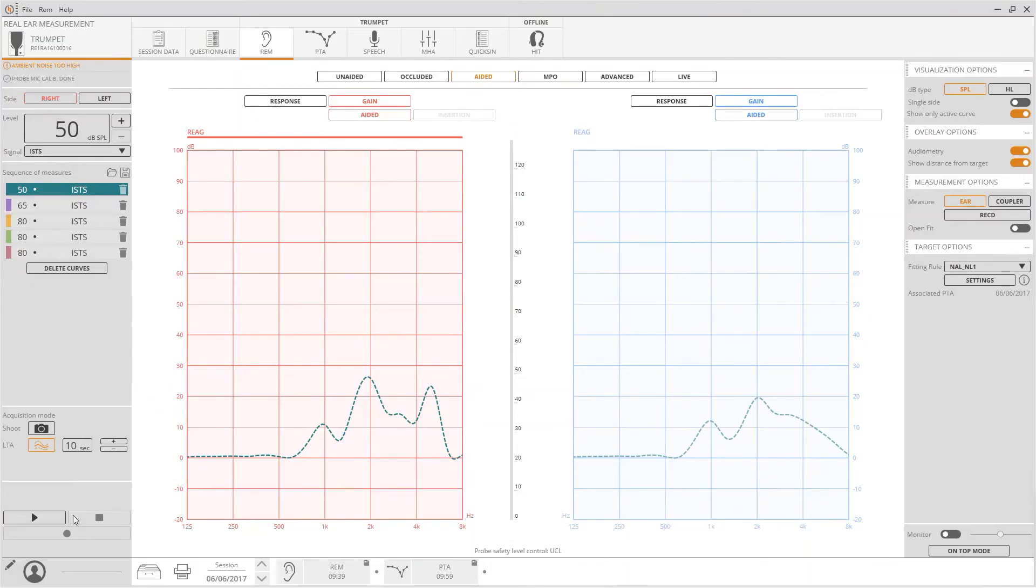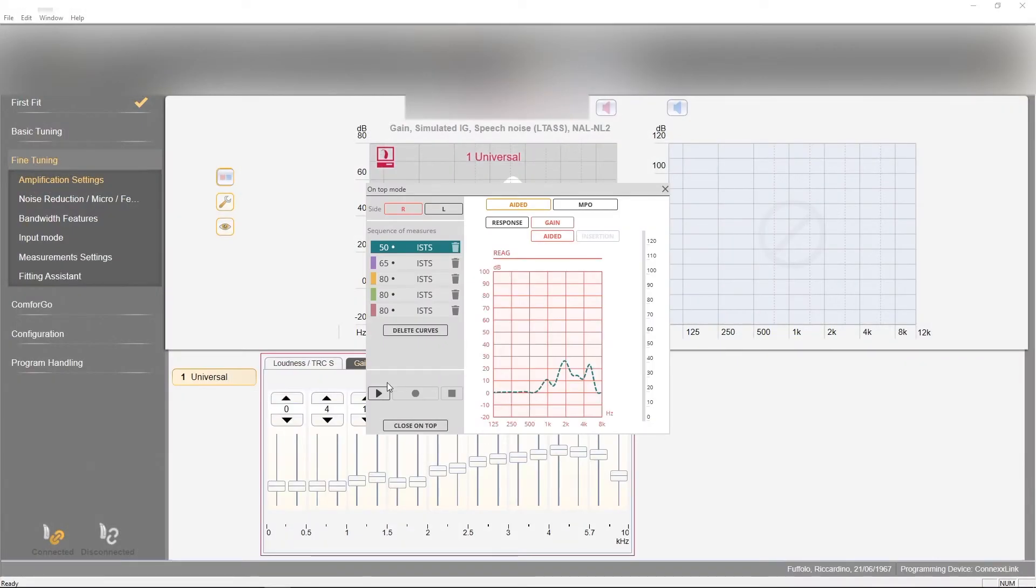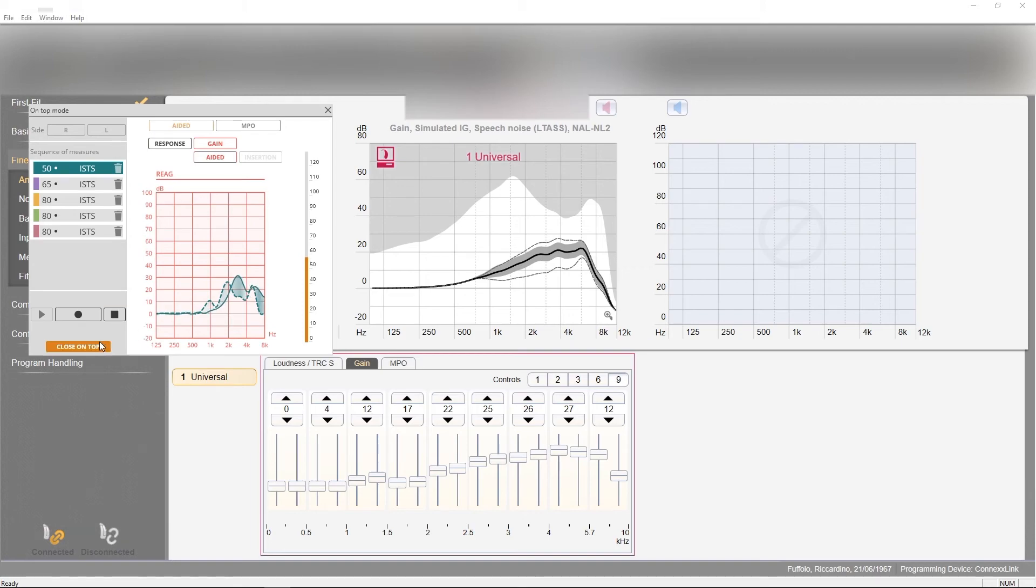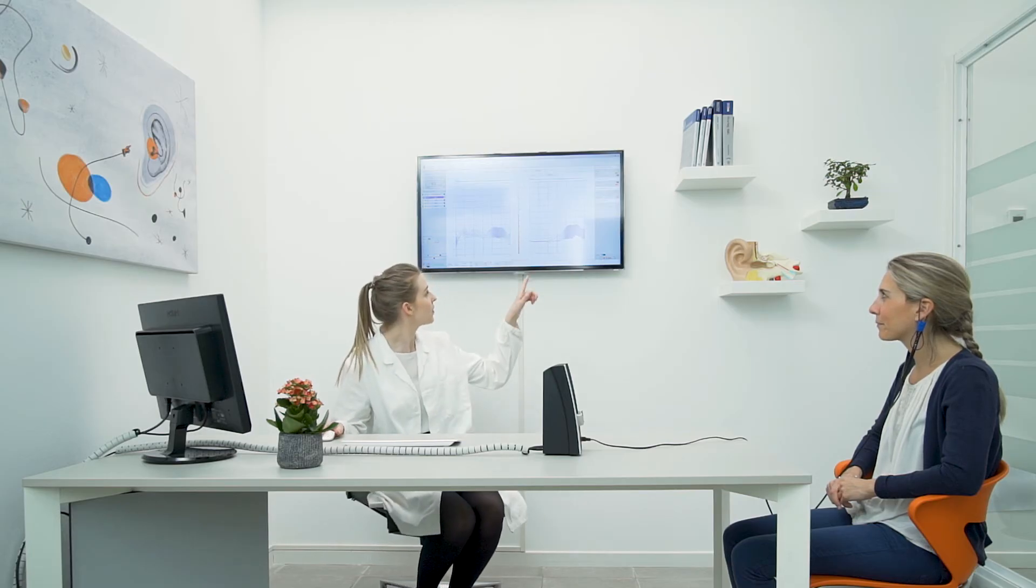Once the measurement has started running, using the on-top mode, it is possible to display the aided gain while adjusting the hearing aid parameters through its own software. In this way it is much easier to set the hearing aid amplification in accordance to the prescription curve.